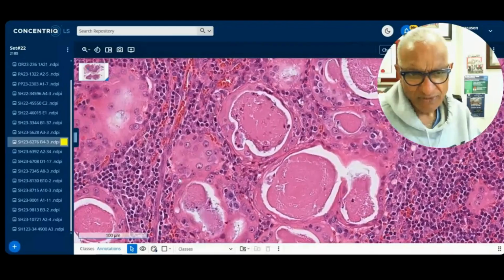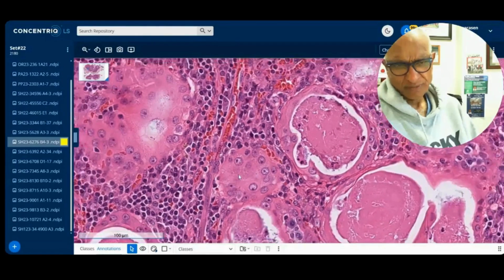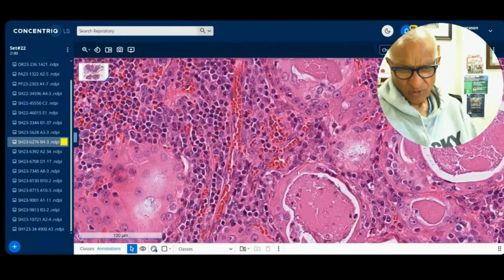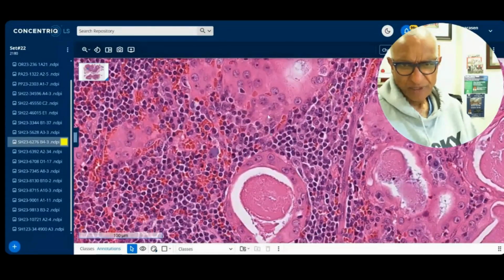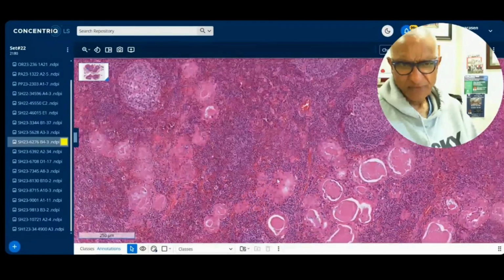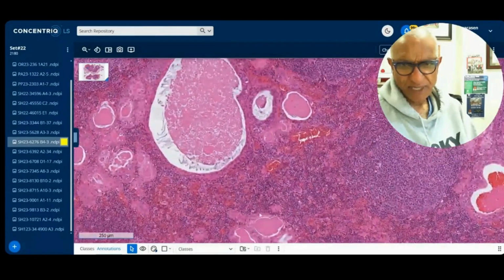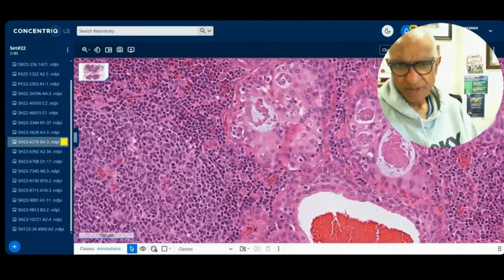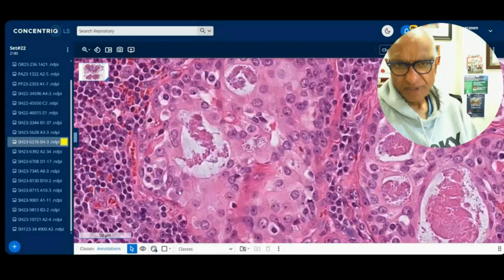Here we go, the same sort of cells, large, abundant, very, very pink, large nuclei, prominent nucleoli, very vesicular chromatin. And some of them having that eosinophilic debris, some having this eosinophilic, what Dr. Baloch calls thyroid-like. Okay, you can see these cells. So let's just move away from those, and there's this intense lymphoid aggregate here. Let's go to this island here. Same thing here. All right. It's higher power for you.